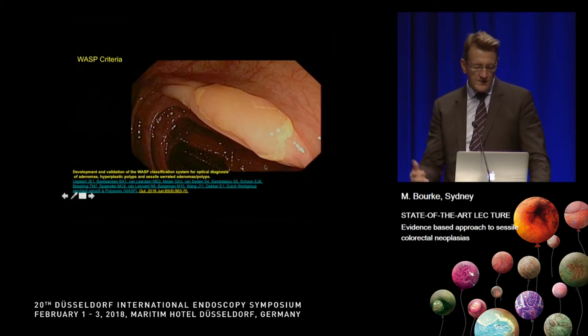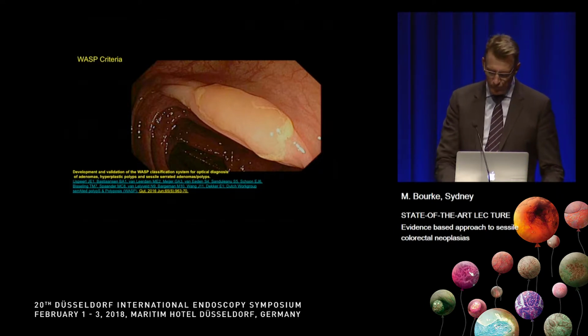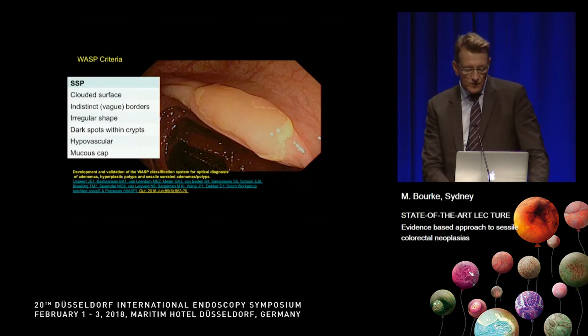So it should be cancer in this area here, at least high-grade dysplasia. We need also to remember the excellent criteria that were put forward by Evelyn Decker and her group in Amsterdam, and these are the WASP criteria for characterising serrated lesions.